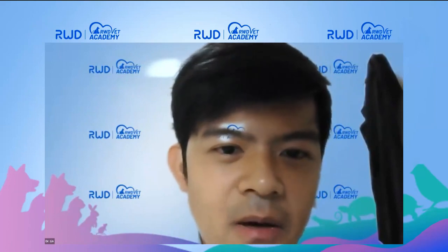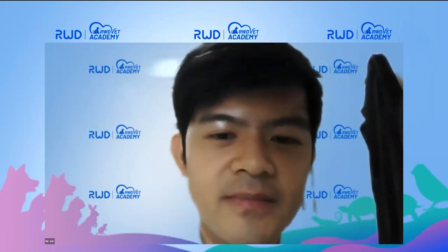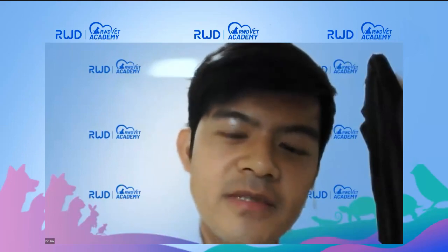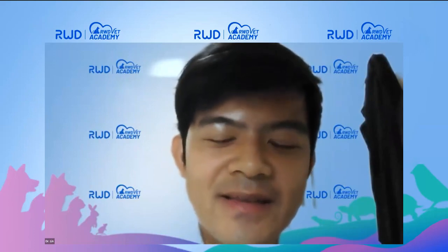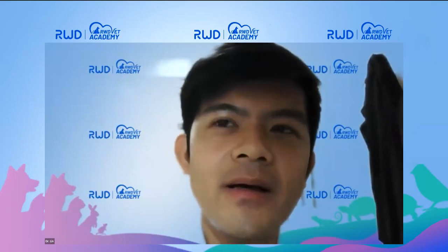The next is, what parameters do you use for laser acupuncture per acupoint, for example frequency, time, power? Oh, it's a good question. I usually use laser acupuncture at 4 joules per square centimeter, and each point about 4 seconds. So it's very quick to complete the 4 sessions. And I will do laser acupuncture about 2 or 3 times per week.